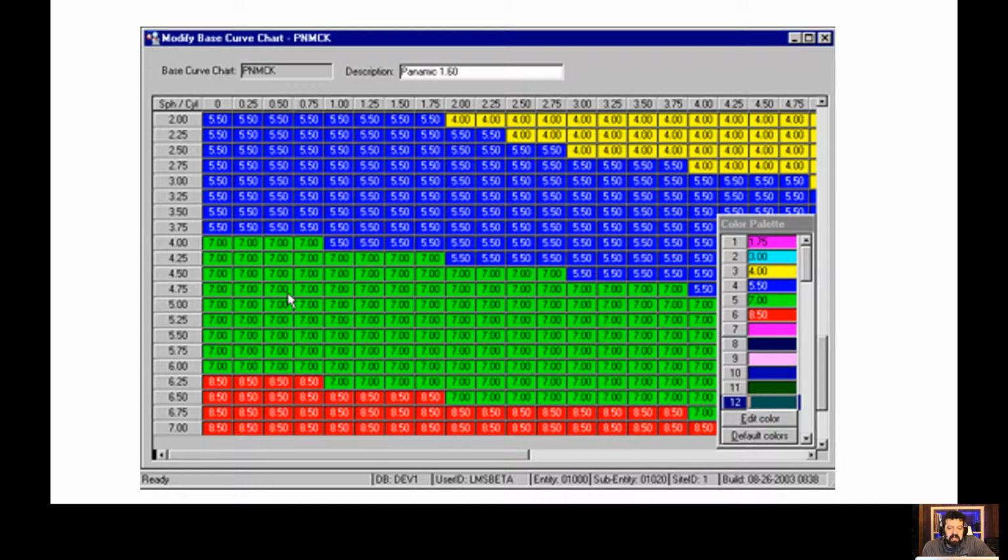I don't, as an optician or as an optometrist, recommend designing my own lenses and putting my own base curves on there just for the heck of it or because some charts showed me, but it is great for problem solving after the fact. There's a lot of money that goes into designing these. There's a lot of effort in engineering, and generally the manufacturer knows through ray tracing and through computations, and don't forget there's asphericity concerns. There's a specific base curve that should work the best for your particular lens design.